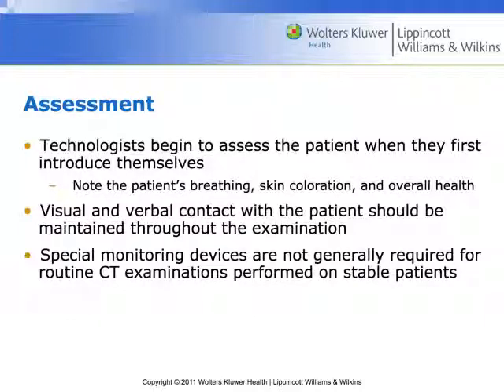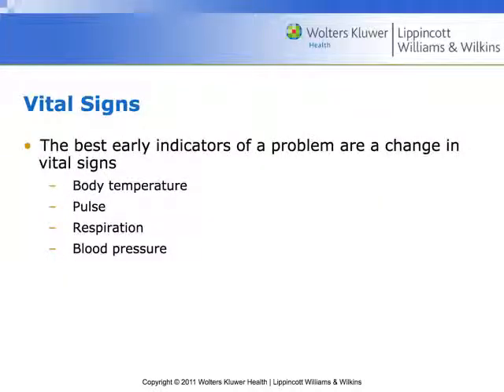Any kind of special monitoring device, fine to take in with a patient. I think getting a blood pressure is really helpful. So it's helpful to have those devices close by. So body temperature, pulse, respiration, blood pressure are all helpful. I used to get flak at one place that I worked at because I would get a blood pressure on just about everyone I did a CT on, with some exceptions. Until there were two or three people where I realized this person does not need a CT scan at all.